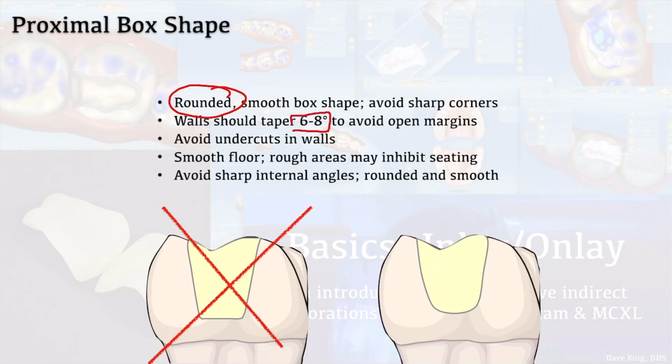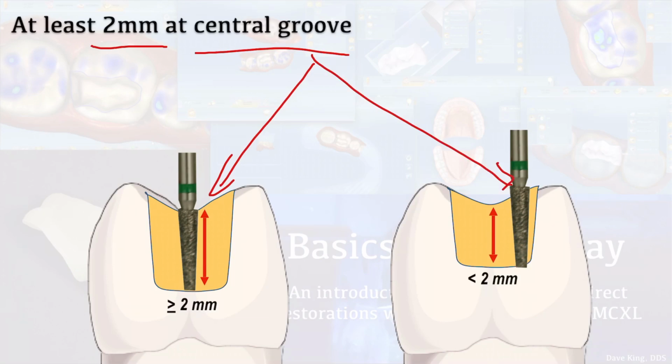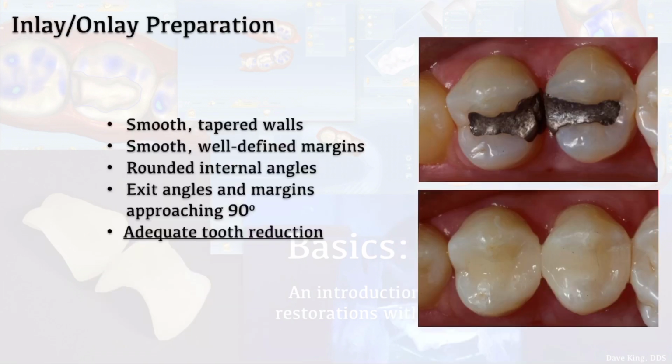Slight taper, 4 to 6. This one has 6 to 8, so very, very slight taper. Avoid undercuts. Nice smooth floor and avoid sharp internal angles. That basically covers everything with regard to proximal box shape. Check your depth, 2 millimeters at the central groove. Make sure it's not too shallow. Depending on where you measure it, it may determine how deep it is, so check it at the central groove here instead of off to the side. You may have this area too thin if you're checking the depth incorrectly. So check your depth at the central groove, so be cautious of that.